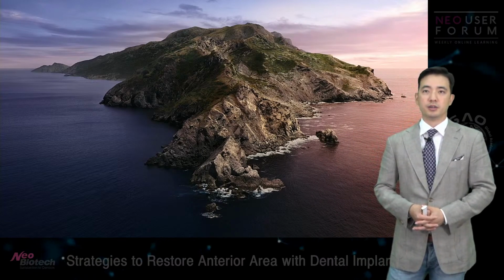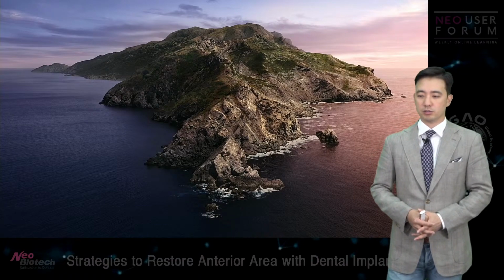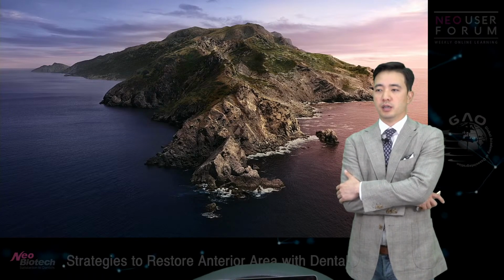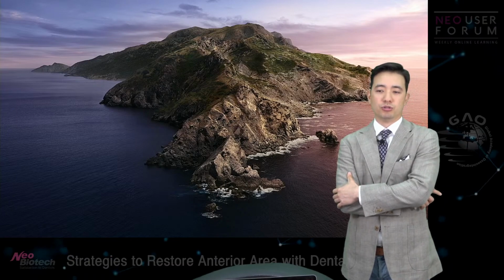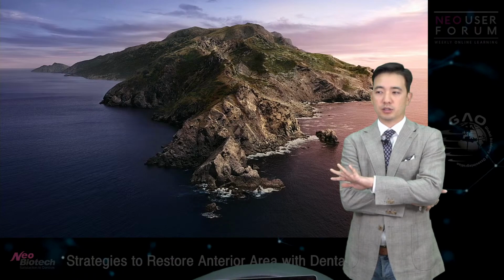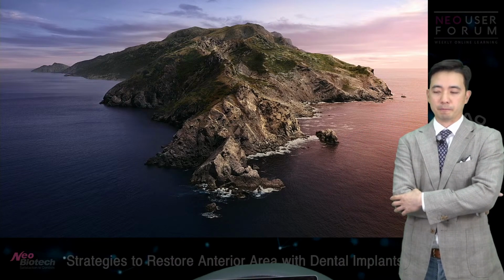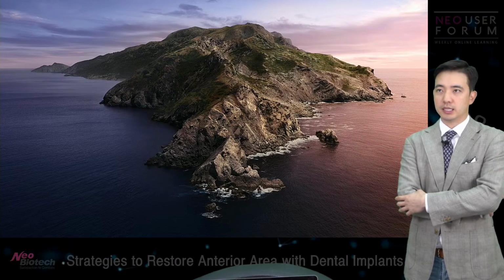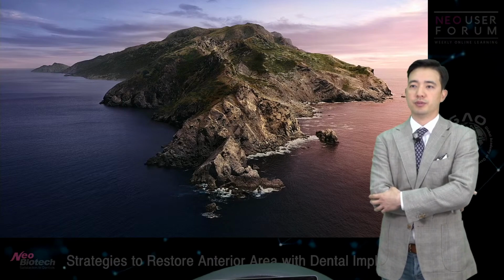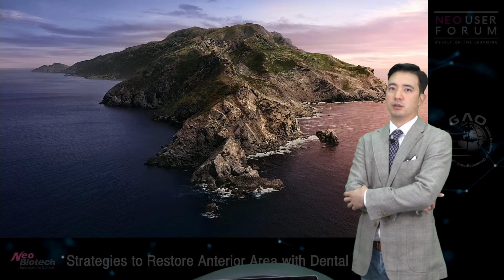So the authors tell you that you do need a backup plan if you're trying to do the socket shield technique. In the case that I just showed you, the root wasn't exposed, but I did have a secondary infection, so I had to find a way to deal with that kind of situation.